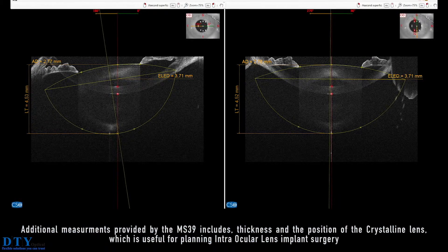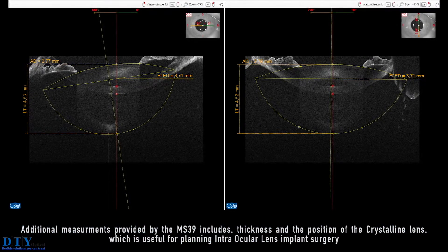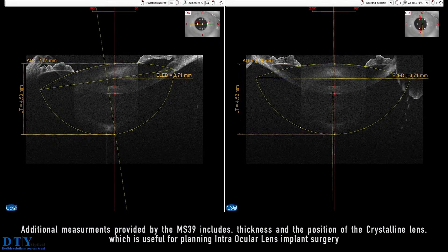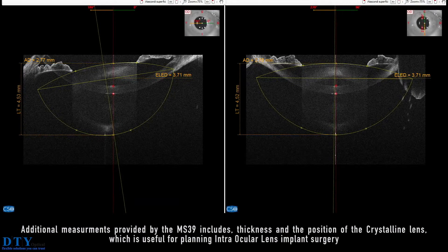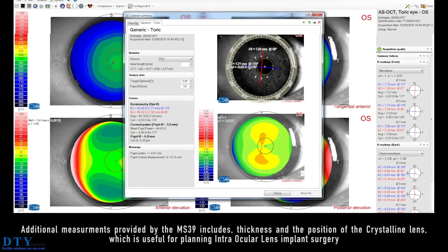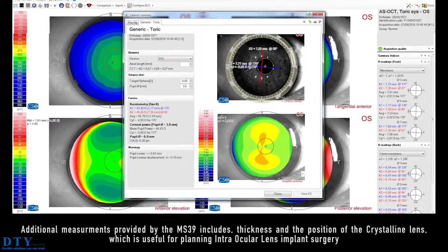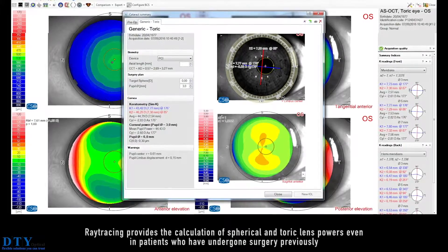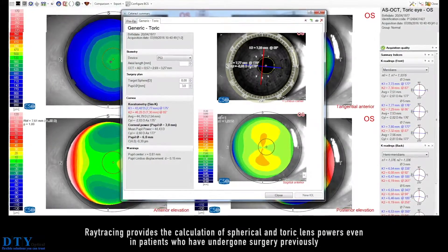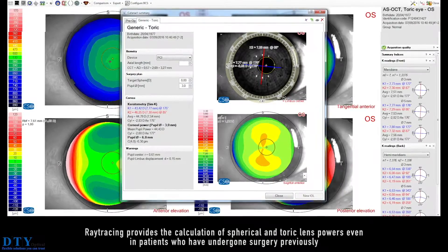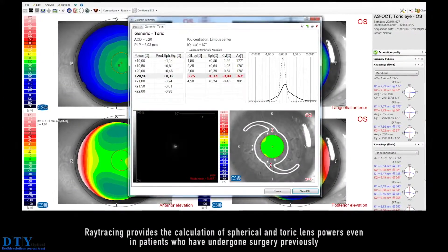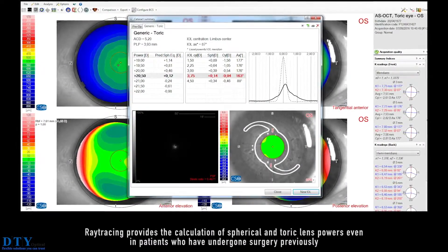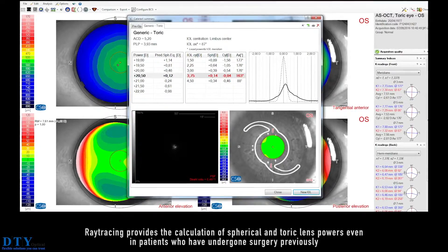Additional measurements provided by the MS-39 include thickness and the position of the crystalline lens, which is useful for planning intraocular lens implant surgery. Ray-tracing provides the calculation of spherical and toric lens powers, even in patients who have undergone surgery previously.